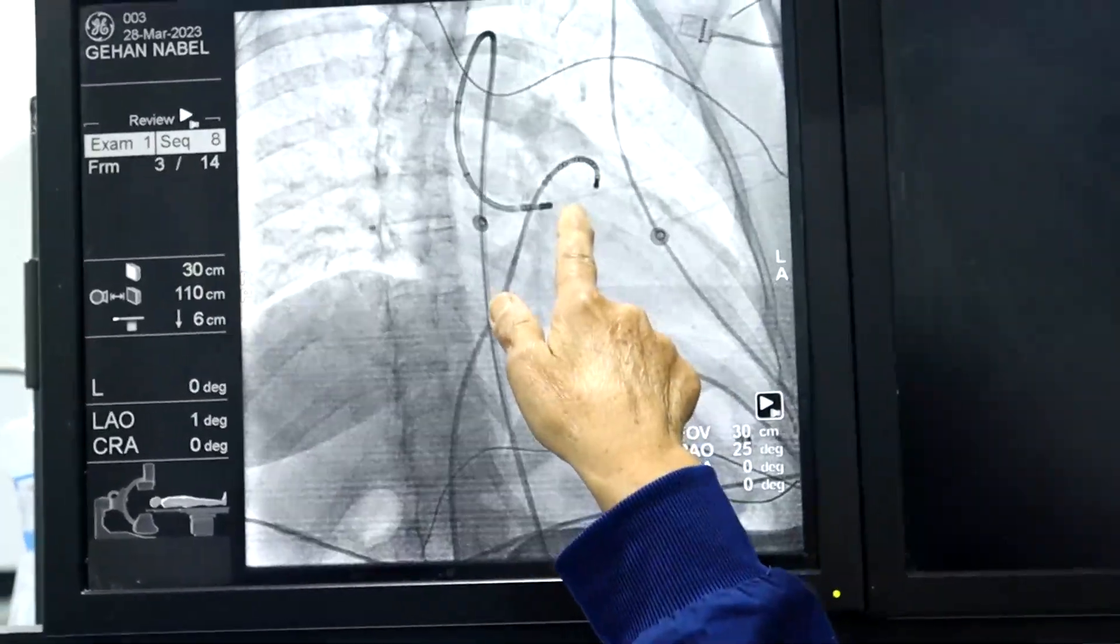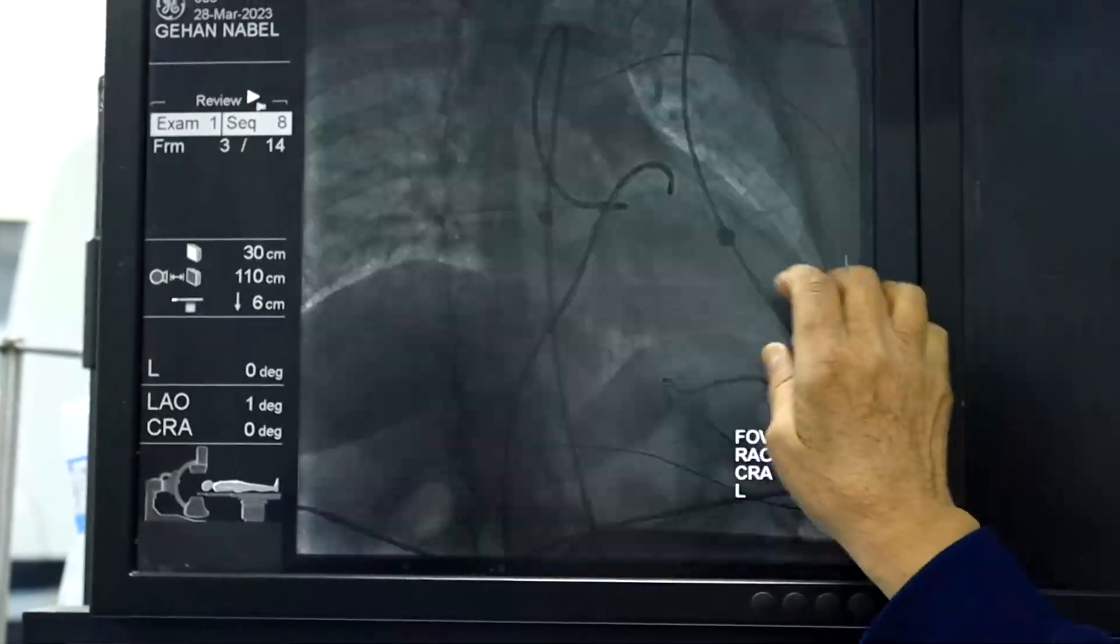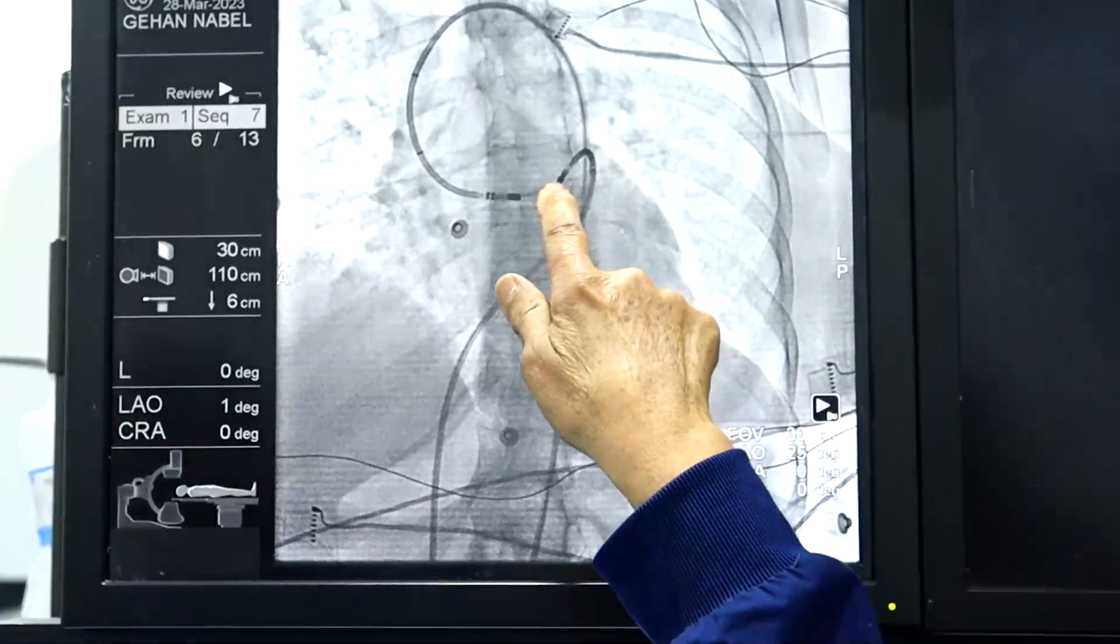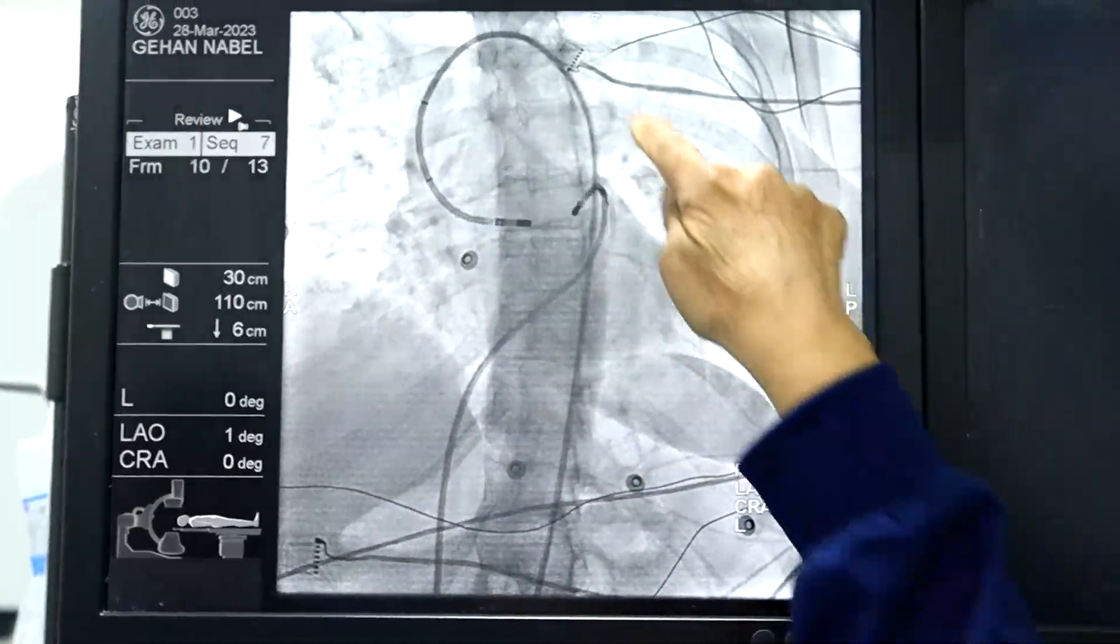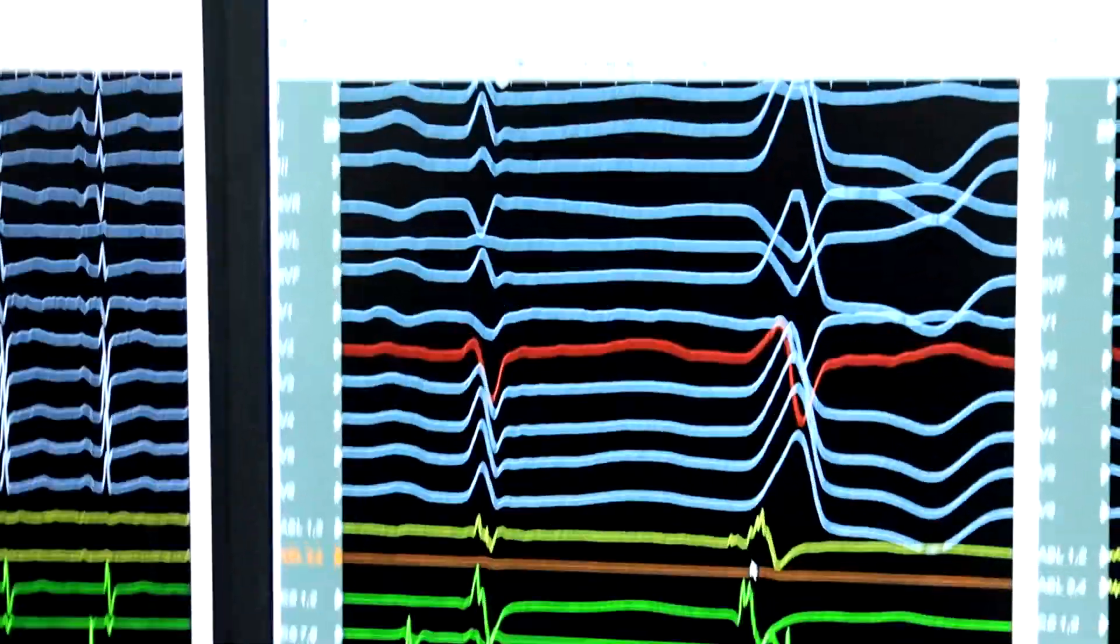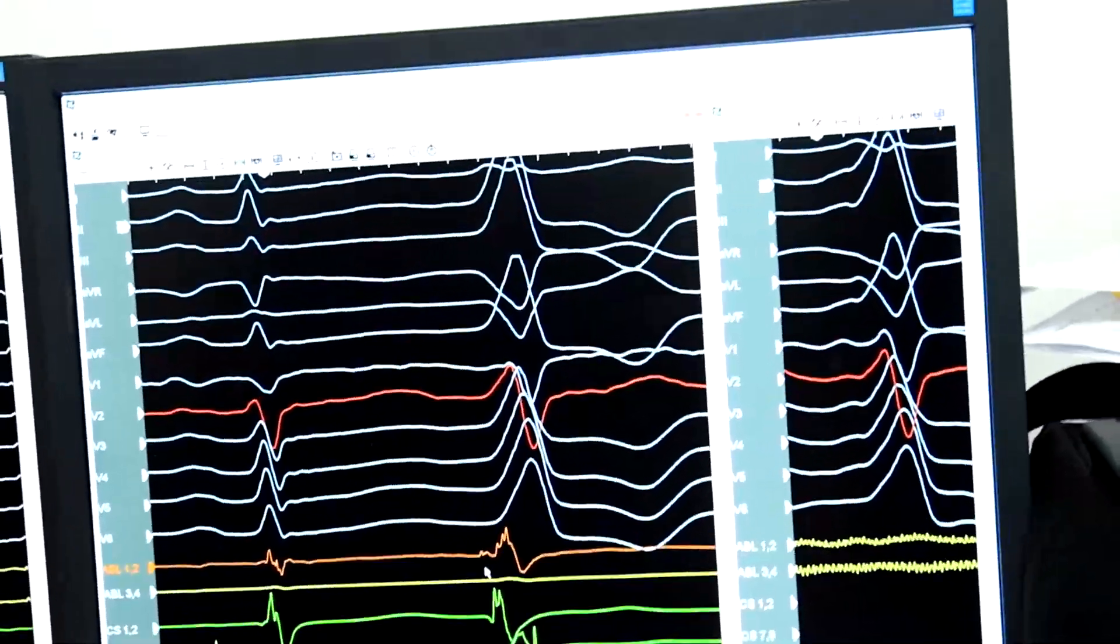Here this is the carto catheter. We use the 3D mapping for better localization and getting good signal. You can see this is very, very short. This is the retrograde approach into the junction between the left coronary cusp and the right coronary cusp.